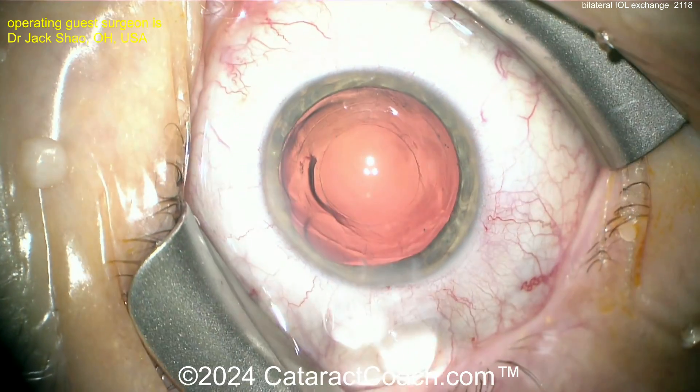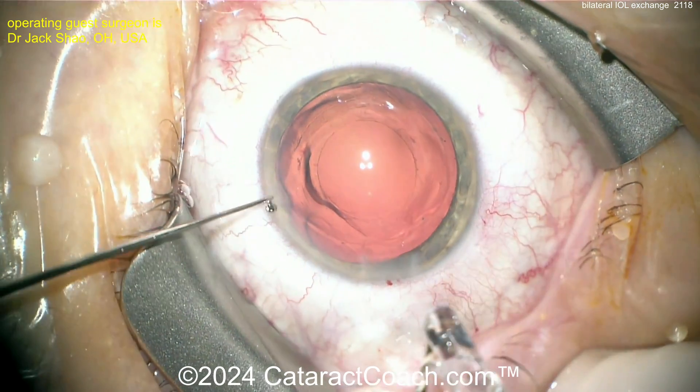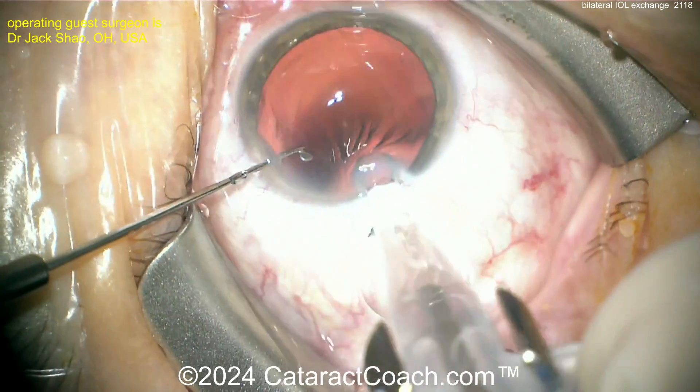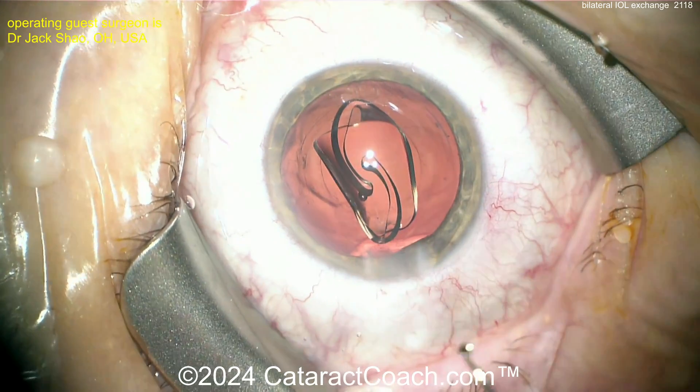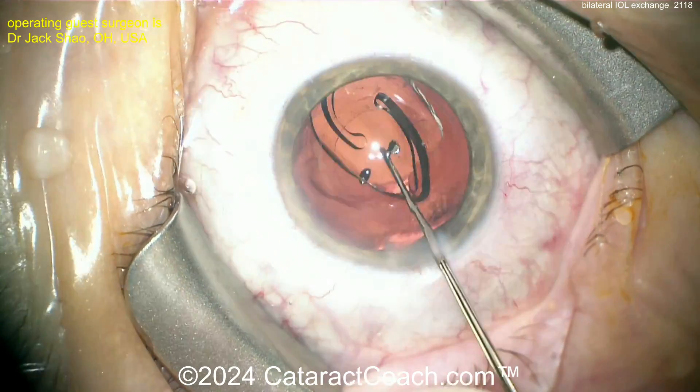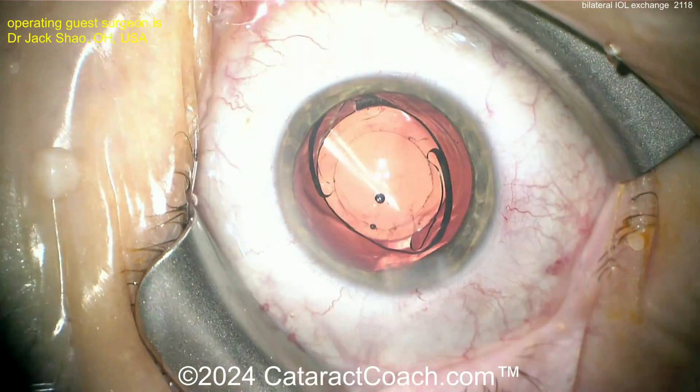Not needing glasses across a wide range — explaining that trade-off ahead of time is very important. Here at the end, a monofocal lens is going into the capsular bag. The monofocal lens will give much better image quality, but you have to tell the patient they're going to lose that range.